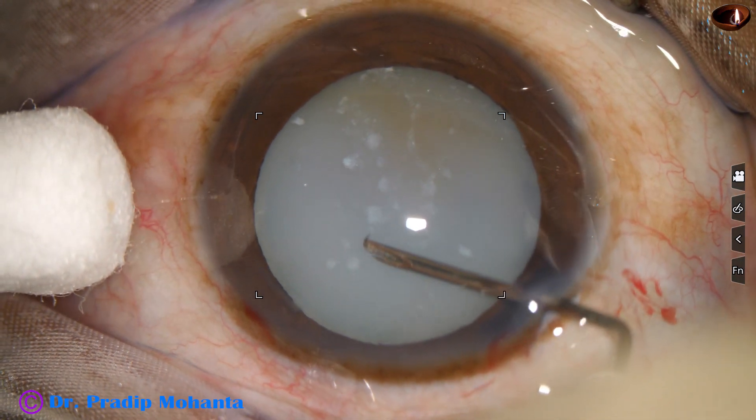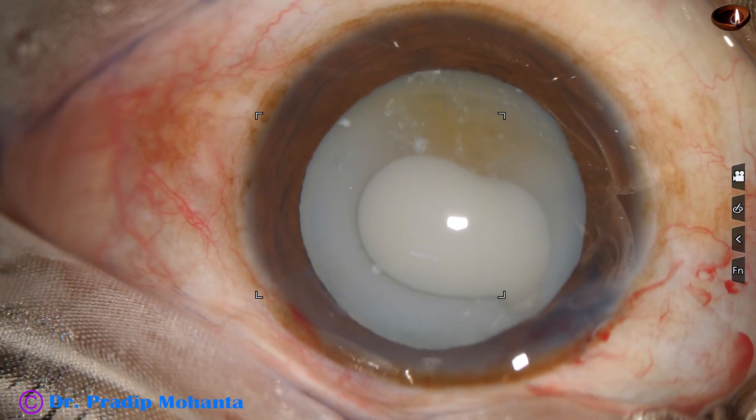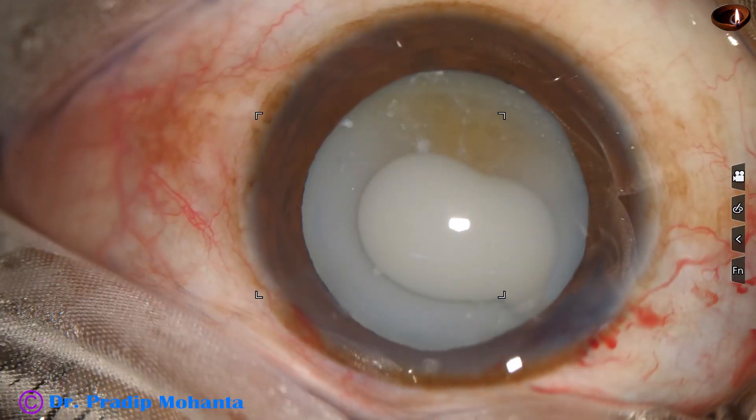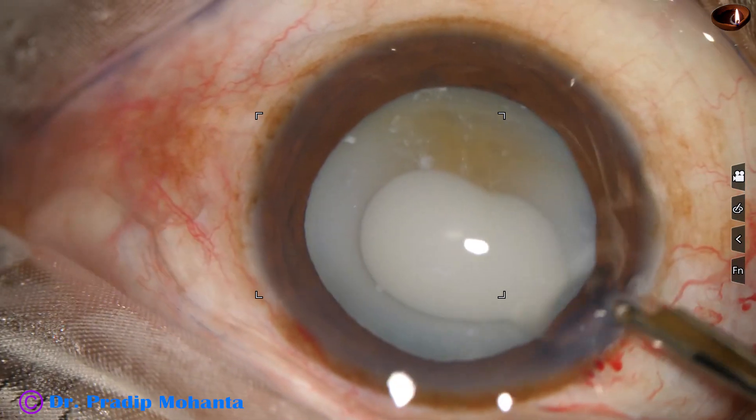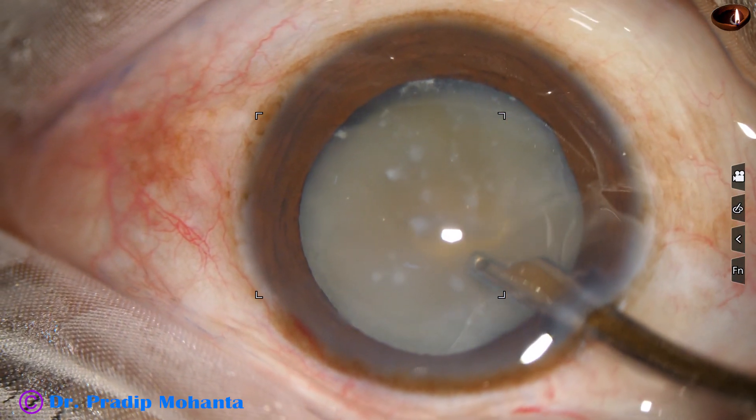See what happens as I make a puncture onto the anterior capsule — milky fluid comes out. I take a 23-gauge Simcoe cannula to aspirate the milky fluid.